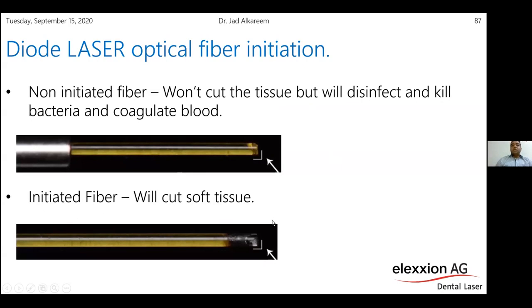The initiated fiber means that the fiber is going to cut your tissue. So that's the difference between using a non-initiated fiber and an initiated fiber. So how to initiate the fiber? You bring the fiber and apply it on a very, very dark surface.